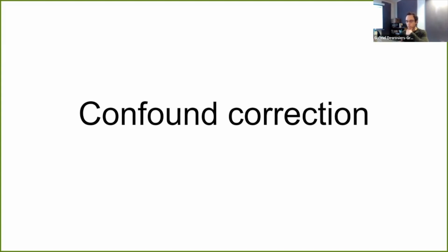But I feel like the main trade-off, if we go faster, is that it might be a more poor registration and a poor head motion correction. So these are things to consider. Otherwise, if there's no question, I'll keep going. But like I said, you can interrupt me if there's a pressing question that comes up as I'm talking.